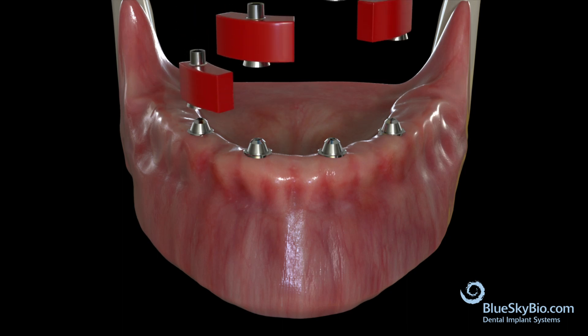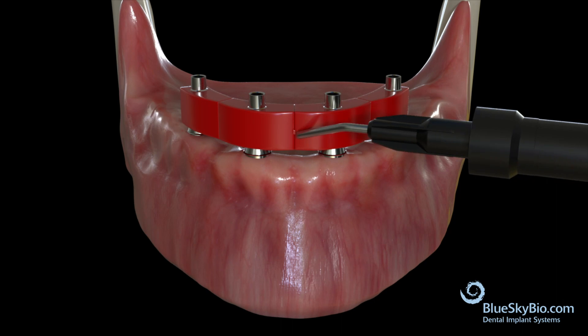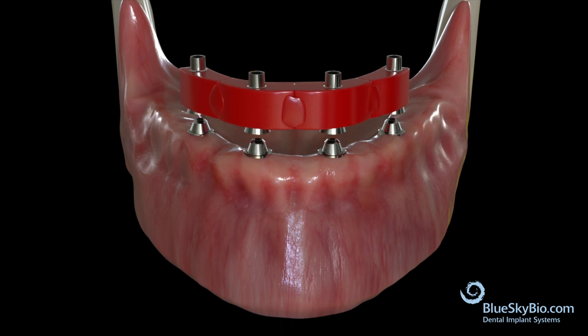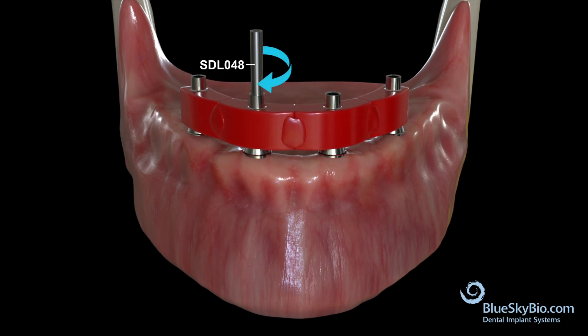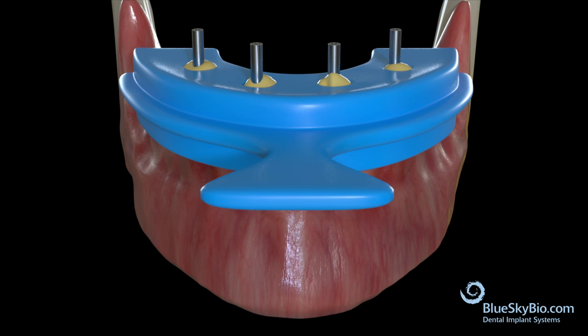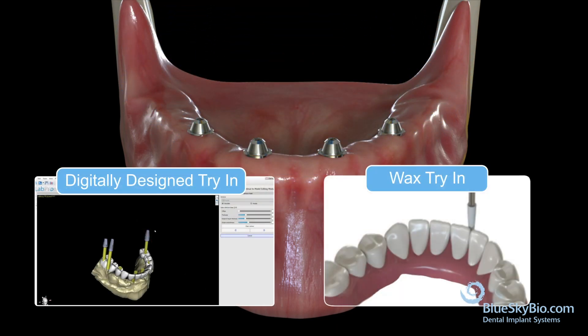However, if it does not seat passively, then the jig should be sectioned to allow each piece to seat fully. Use composite or pattern resin to lute the pieces back together in this new passive position. Now take a new impression with the verification jig in place, and send this to the lab to allow them to modify the master cast.